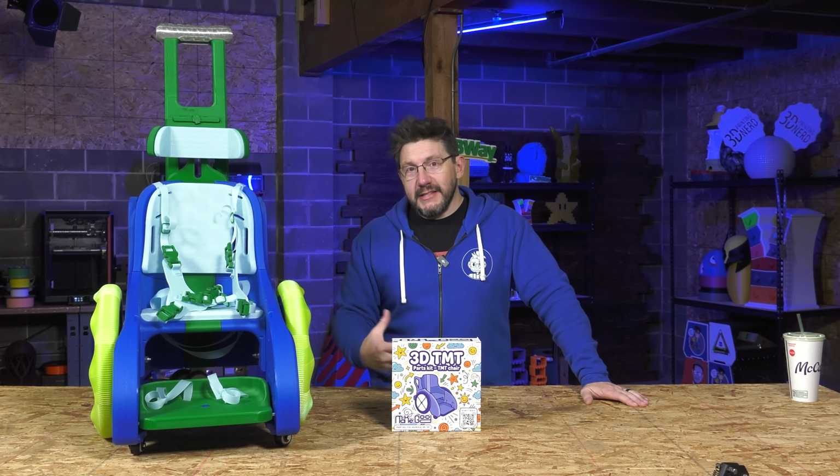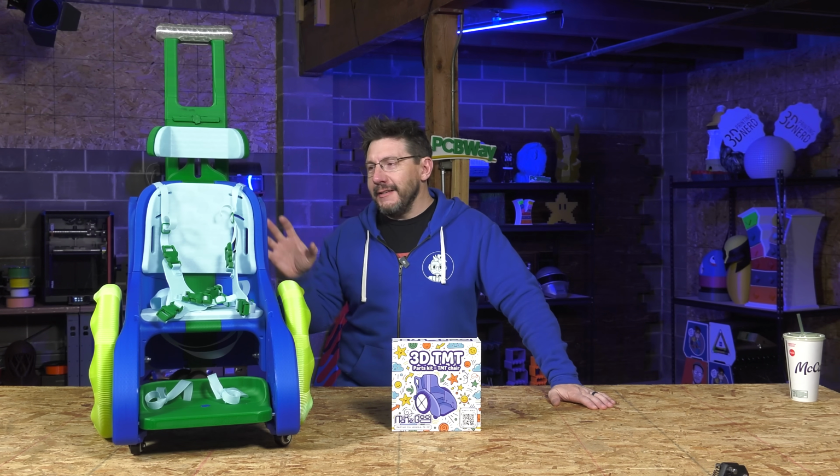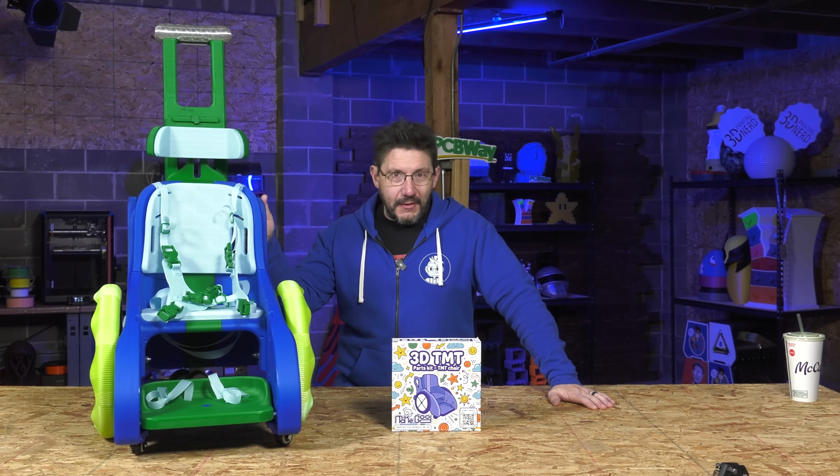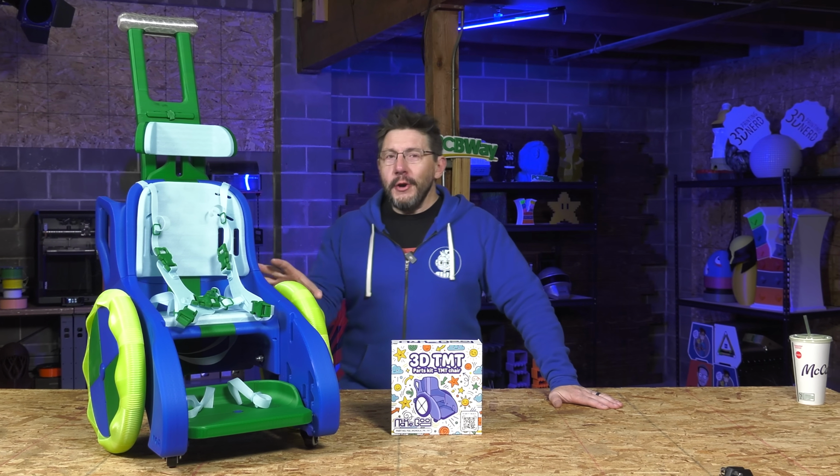And in this case, the family in need, that little boy, his name is Waylon, he wanted blue and green, and he and his family are on their way to the studio right now. So I got to get cleaned up because some wonderful little child is going to have this chair really soon.